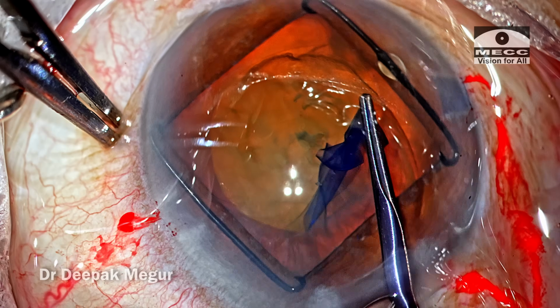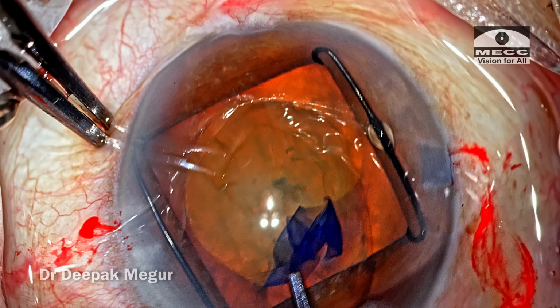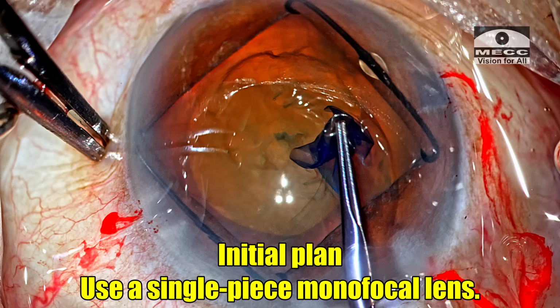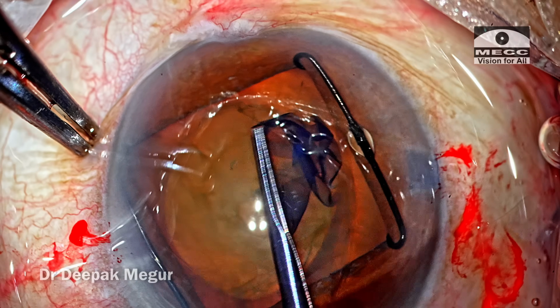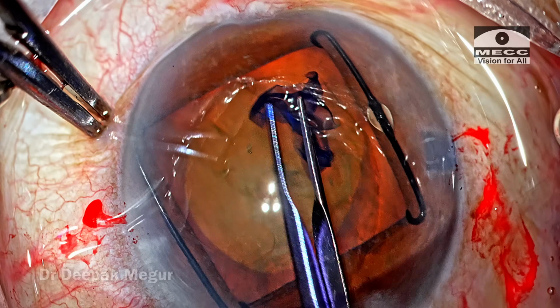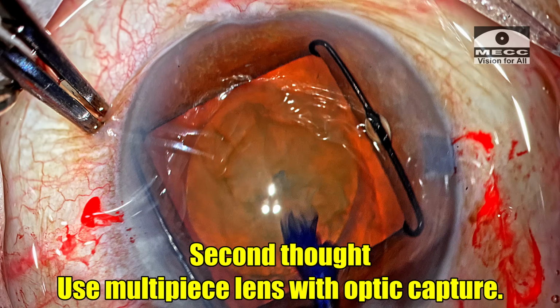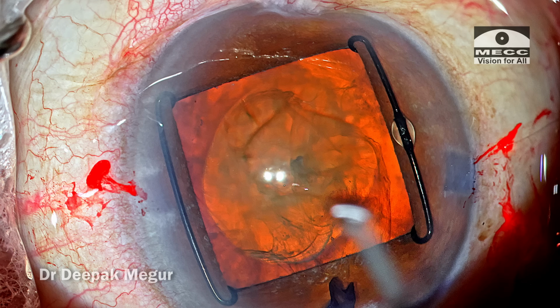At this point, I need to make up my mind about what technique of IOL implantation I'm going to use. Now this case was scheduled for a single piece monofocal lens, but I'm now having second thoughts of whether I should continue with a single piece lens or go ahead and use the IOL trap technique with a 3-piece lens. A 5 mm rhexis is done.